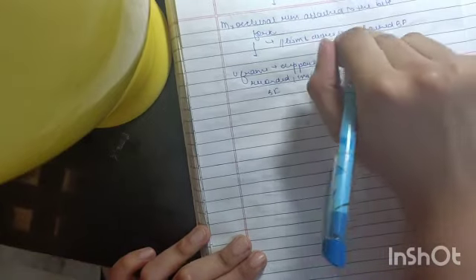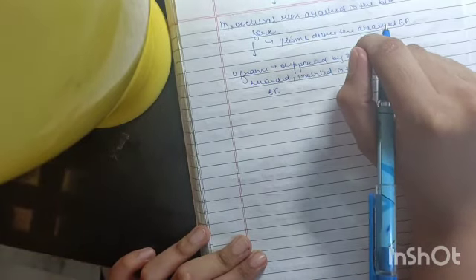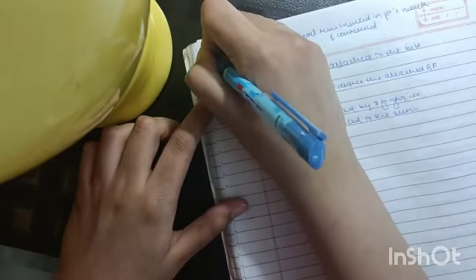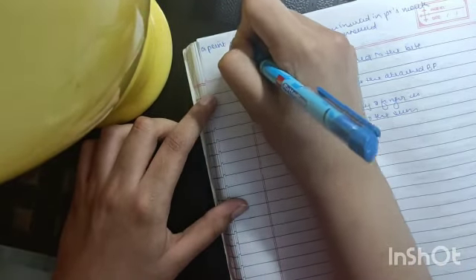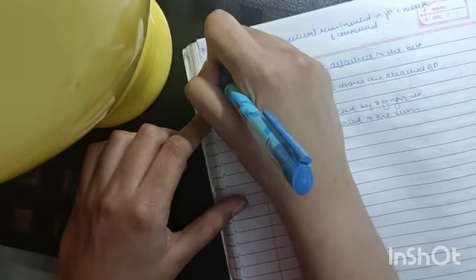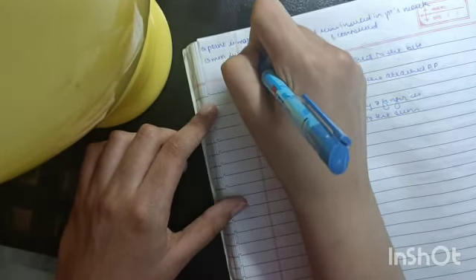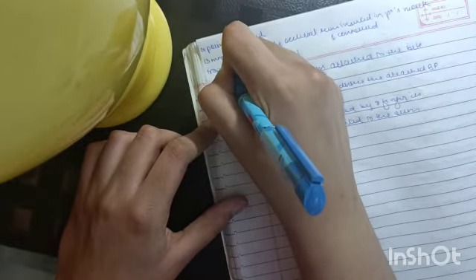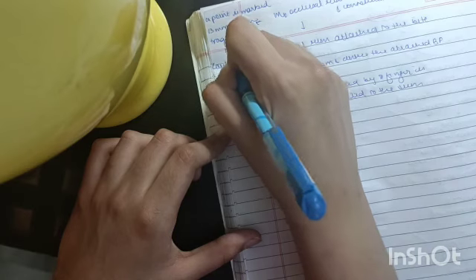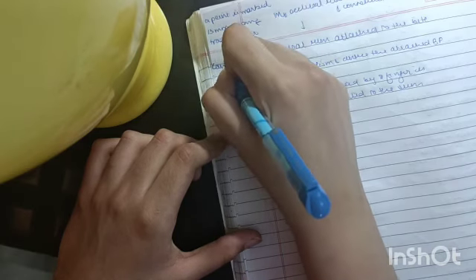Now over here, after we put in the maxillary occlusal rim, we have to do a step in which we mark a point. A point is marked 13 mm from the tragus of the ear, that is, the canthotragal line is marked.